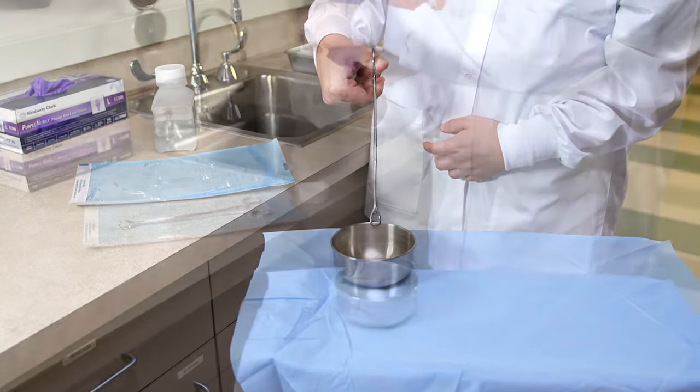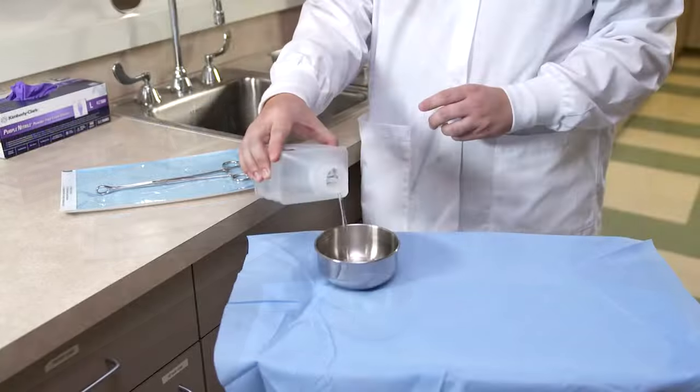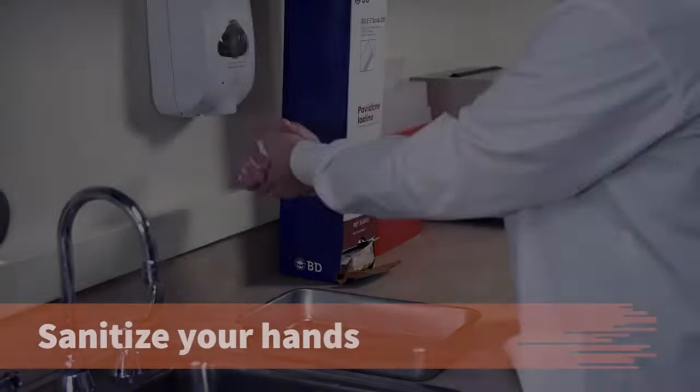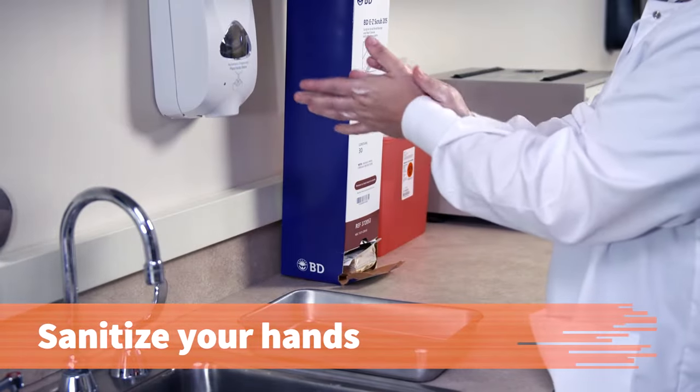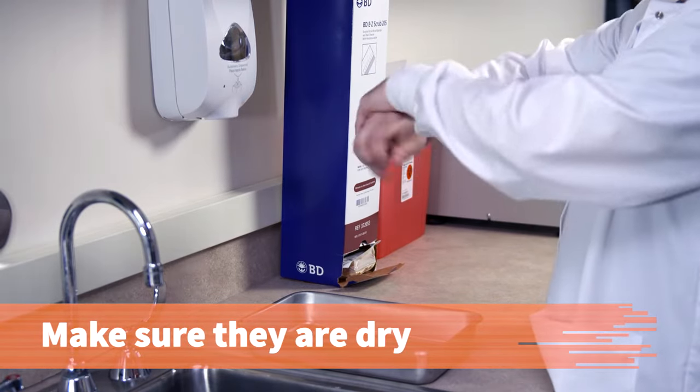In this procedure, you will learn how to pour a sterile solution into a sterile container sitting at the edge of a sterile field. Sanitize your hands and make sure they are completely dry to reduce the number of transient flora on your hands and forearms.